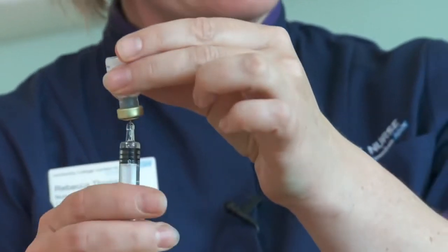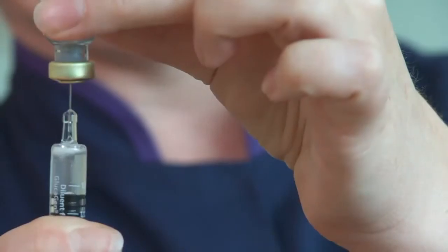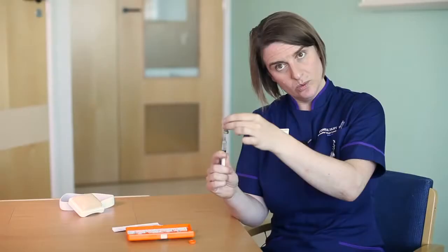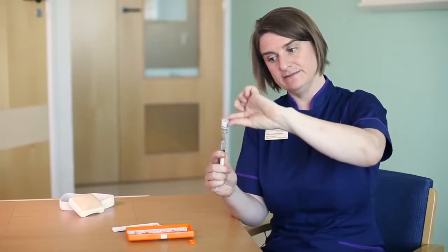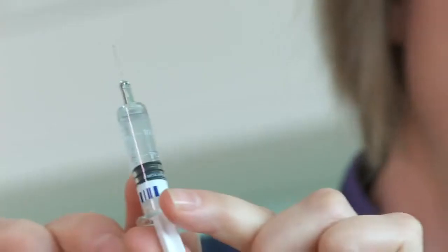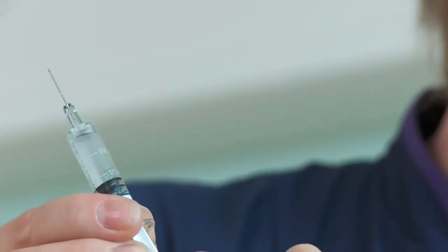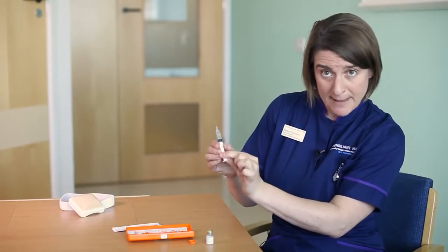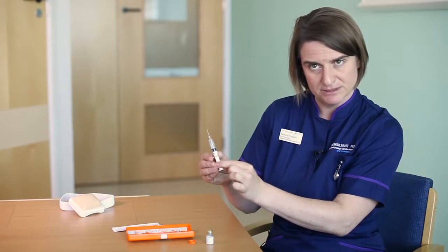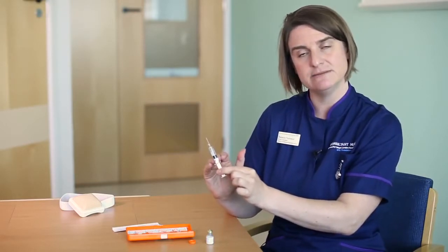So inverting the syringe, I'm going to draw up all of the fluid from the vial. Once I've got all of the fluid in the syringe, I'm going to take the vial off the syringe, and then you can see that all of that is now in the syringe. You don't need to worry about air bubbles for this. There are a lot of people who ask questions about, do I need to get rid of the air bubbles? Don't worry, this isn't going to be given into a vein, it's going to be given into the muscle, so that's absolutely fine.